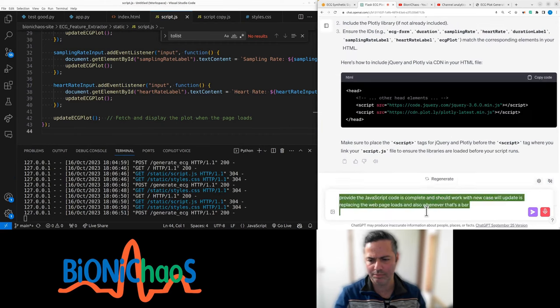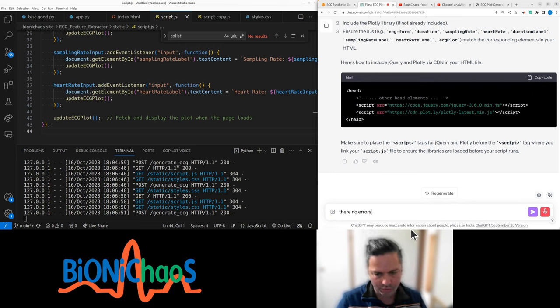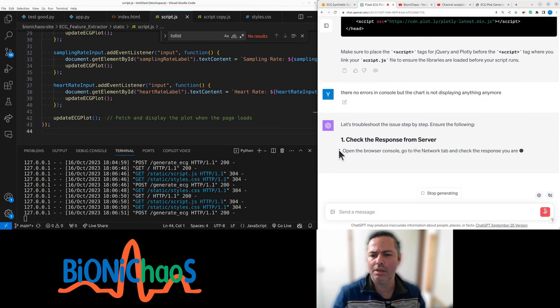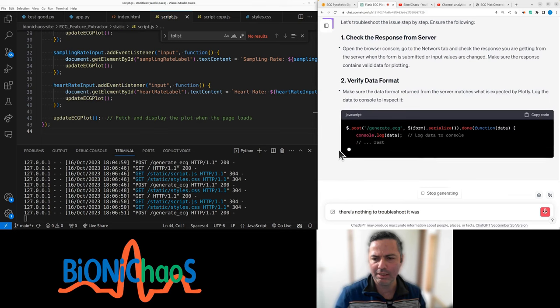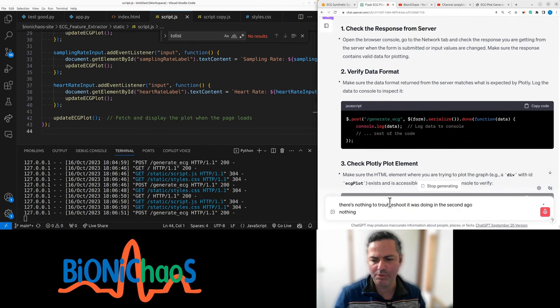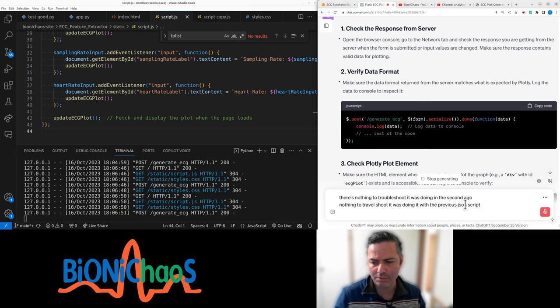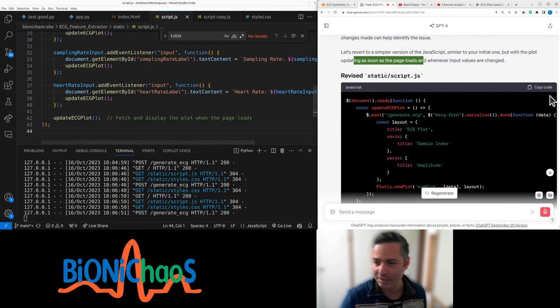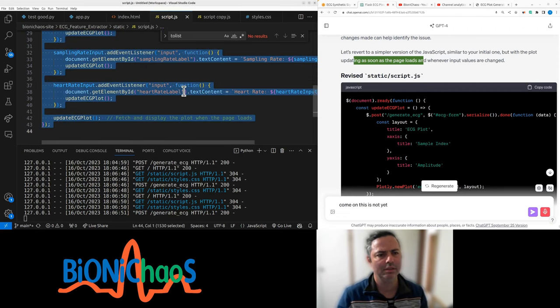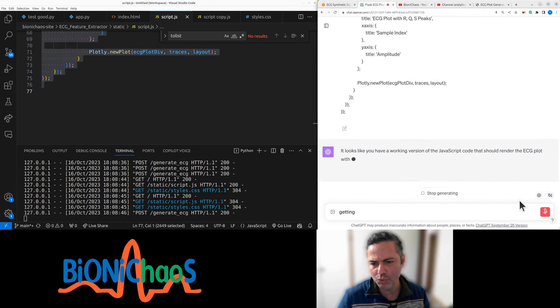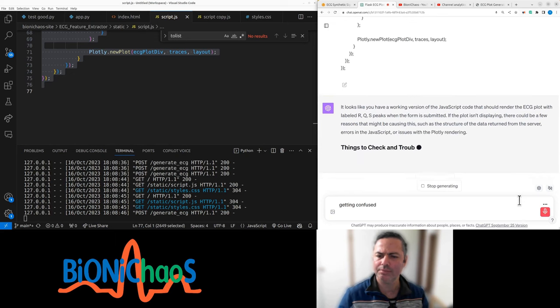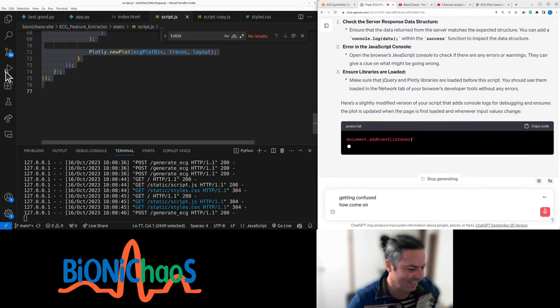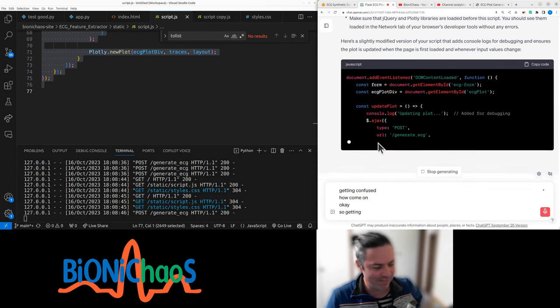There are no errors in console, but the chart is not displaying anything anymore. There's nothing to troubleshoot. It was doing it a second ago. Nothing to troubleshoot, it was doing it with the previous JSON script. This is not yet. Getting confused. It's now getting all mixed up.